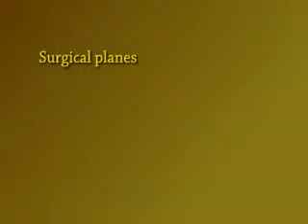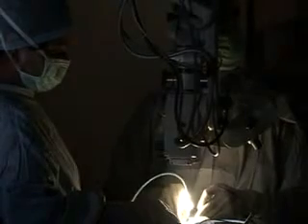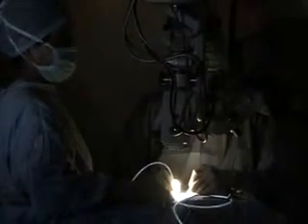While endoscopic surgical planes, views, and magnification are a powerful tool for treatment of complex vitreoretinal conditions, they may not replace conventional vitrectomy, but may be an option in cases with a compromised anterior segment.